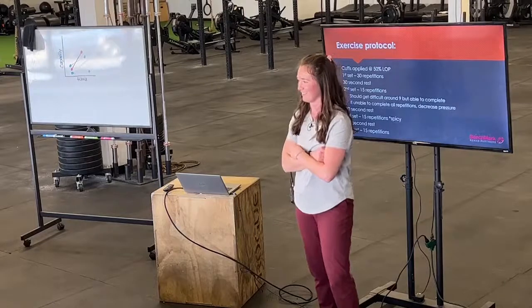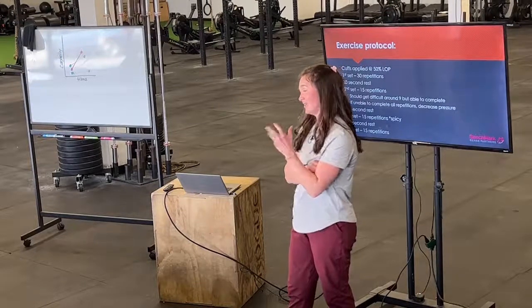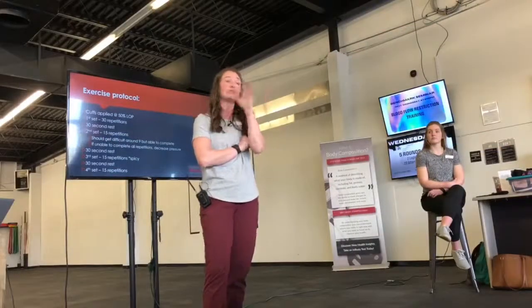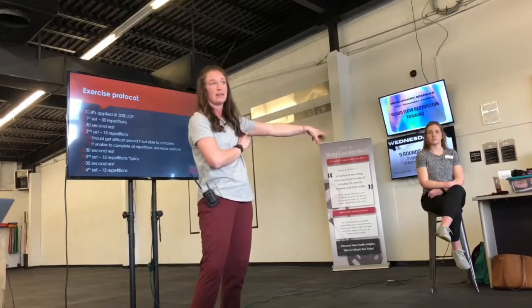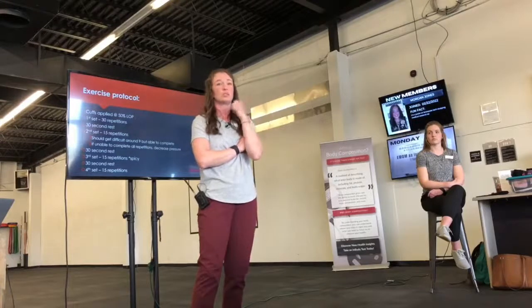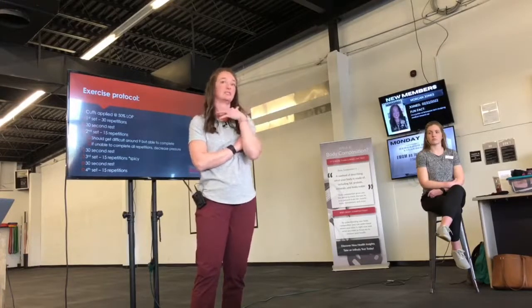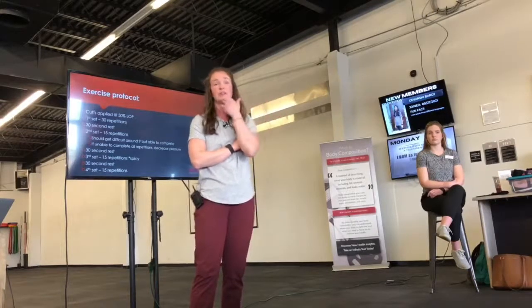Okay, here we go. We're rolling now. You can imitate the same thing with flossing. You don't have to use this; this is just a company that we use. But you can use electric cuffs, there's just tubing that people use.